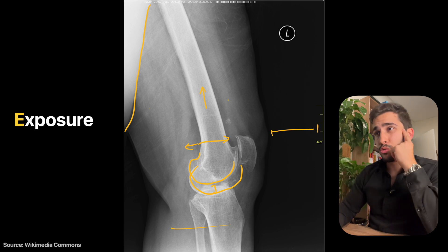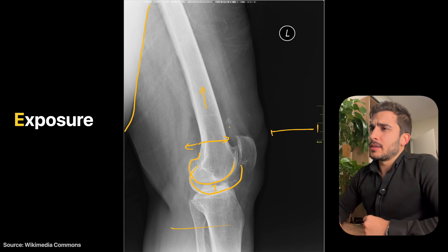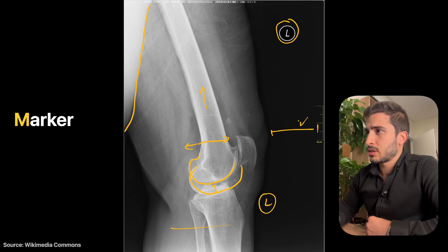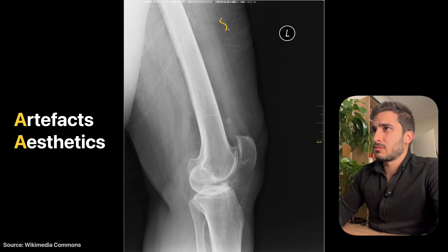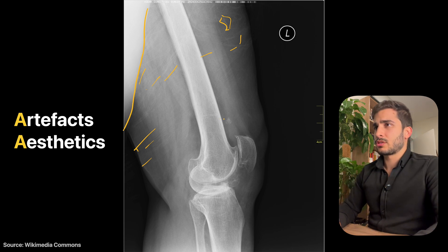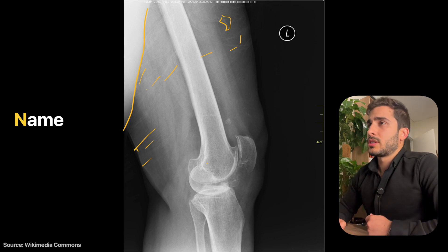Exposure is quite good — contrast levels are adequate and bone texture detail is clear, so no major changes needed there. The left marker is correct; bringing it closer and reducing side-to-side collimation would improve the image. Aesthetically, it's not the most appealing due to the clothing artifact lines and the lead shield covering some soft tissue — not covering bone, which is good, but affecting the soft tissue region. Brightness and contrast could be slightly improved in post-processing.